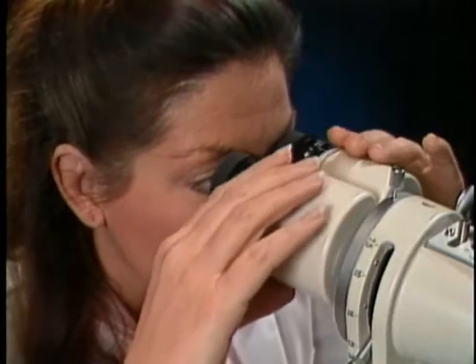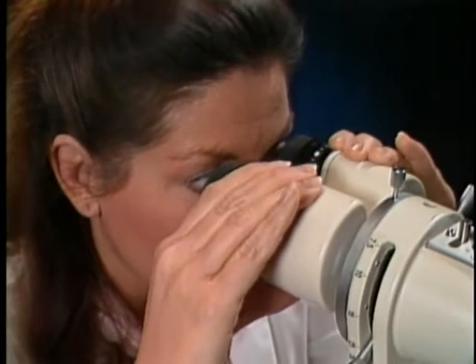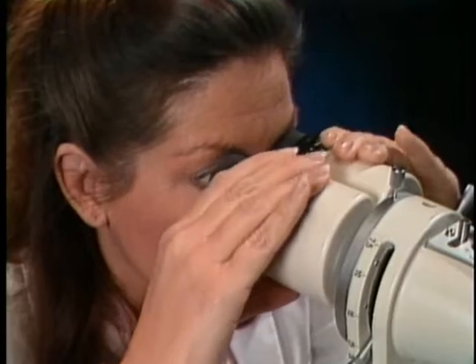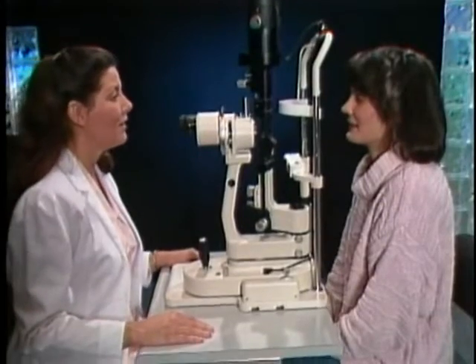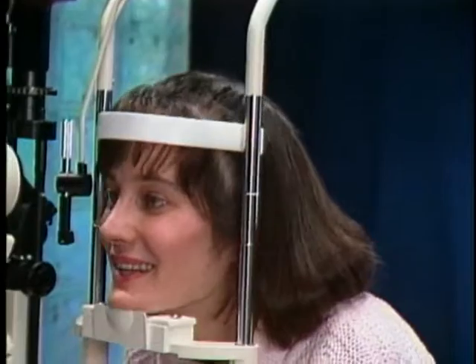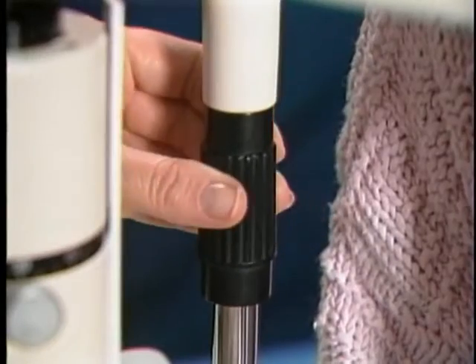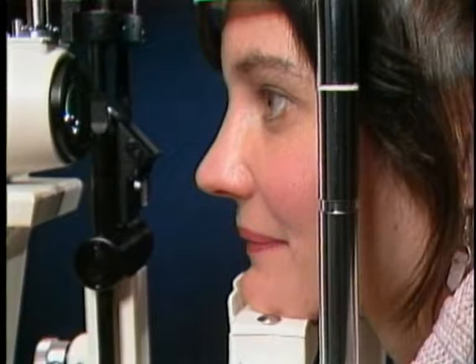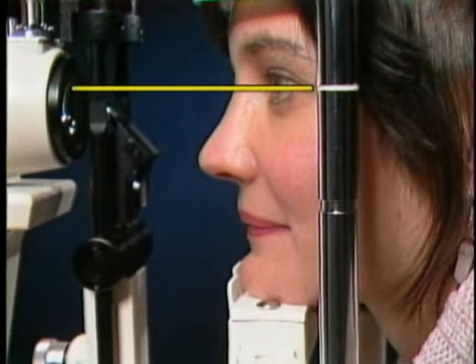Adjust the interpupillary distance of the eyepieces for binocularity and stereopsis. After seating the patient, adjust the table to a comfortable working height. Position the patient against the chin and forehead rests, and adjust the instrument so the index mark on the chin rest assembly aligns with the outer canthus.